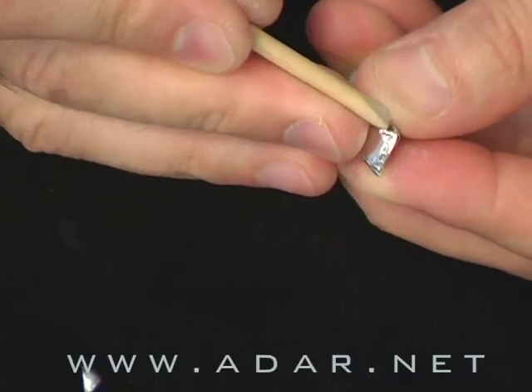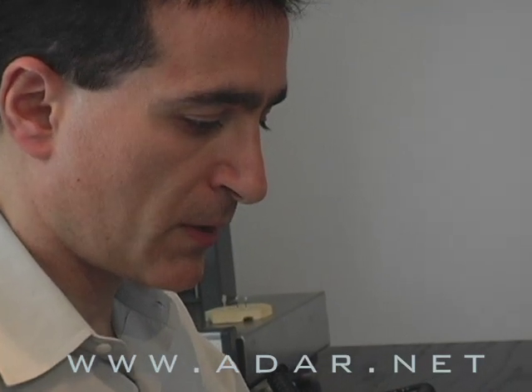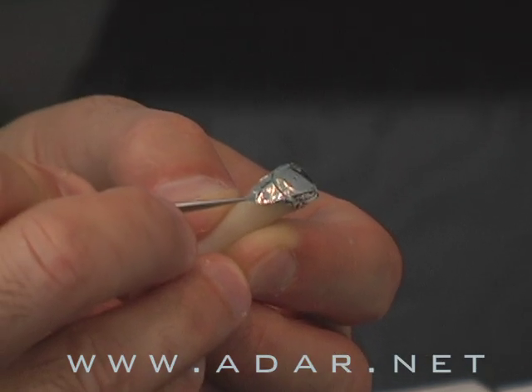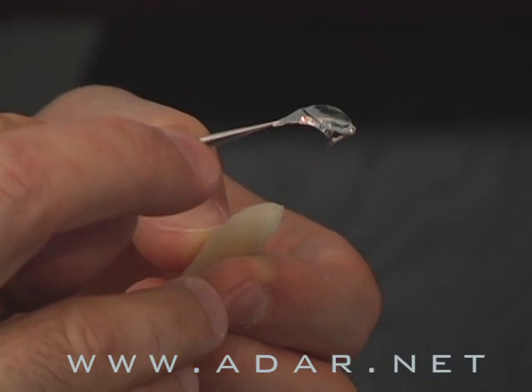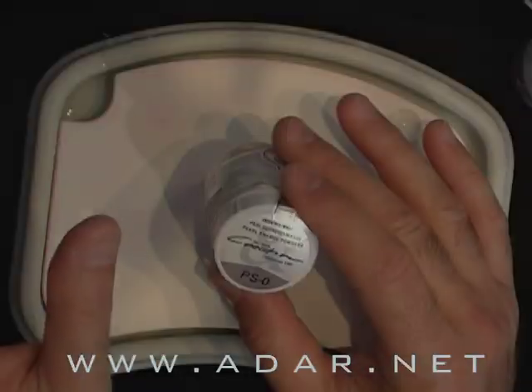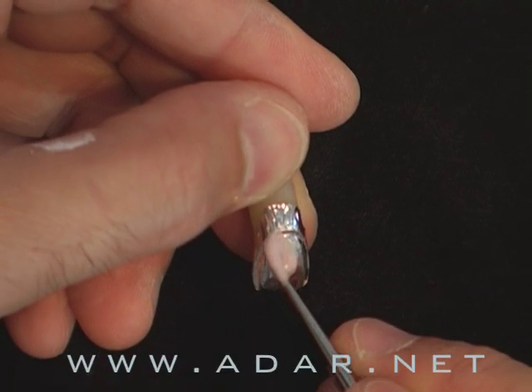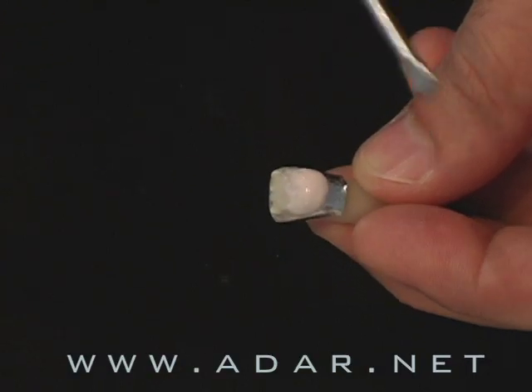You'll learn how to burnish this restoration without any wrinkles, so it's easier to remove from the die, as well as take the foil off from the restoration. This DVD will teach you how to apply your layers. For patients who are skeptical about the outcome, you can learn with this technique how to fabricate opaque veneers versus translucent veneers.